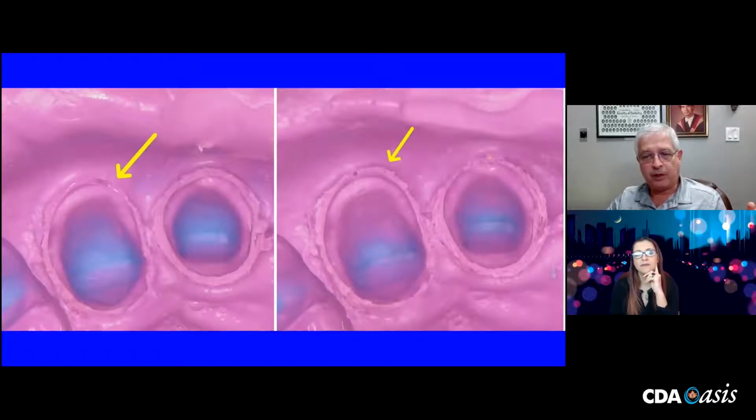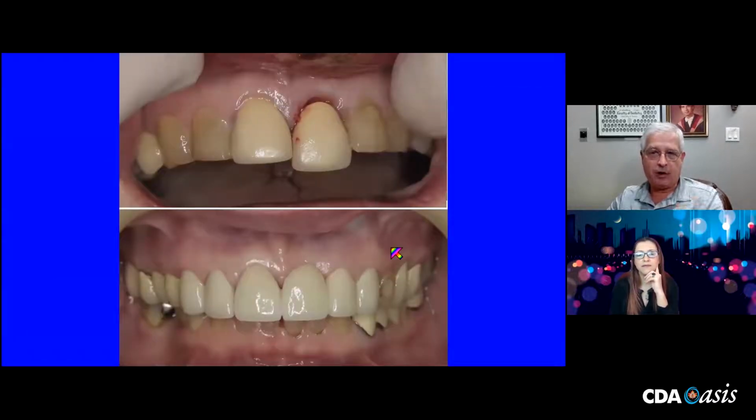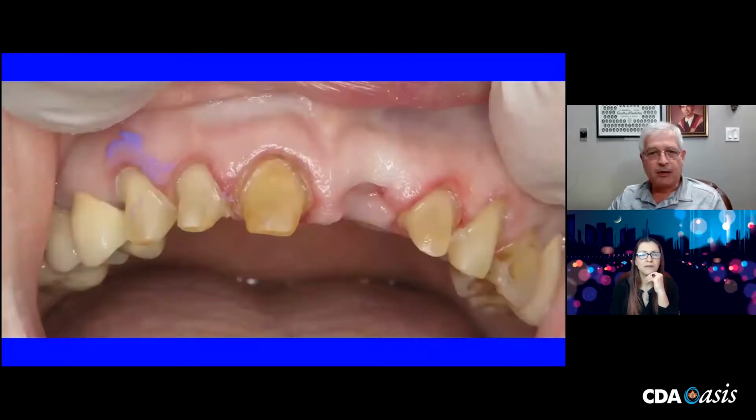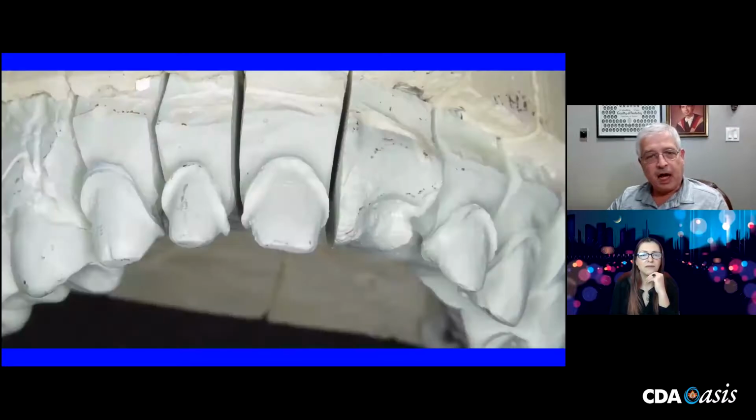But when there's a large case and I'm going from here to here on multiple abutments, I want to give somebody a restoration that will withstand the test of time. And that means eliminating all the small errors. I don't want to pass those down the line. So I try to prepare teeth as correctly, as atraumatically and as judiciously as possible. Once I've done that, and I spend a lot of time on tooth preparation, I've got to get all that information here on a stone model. Digitally, again, that has to be addressed by somebody else.